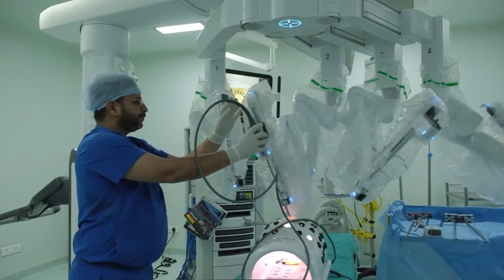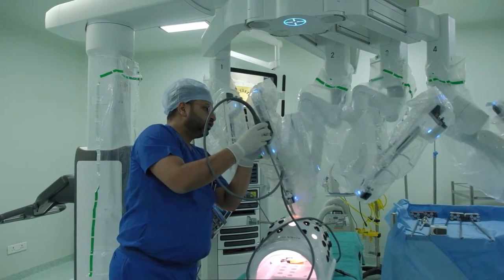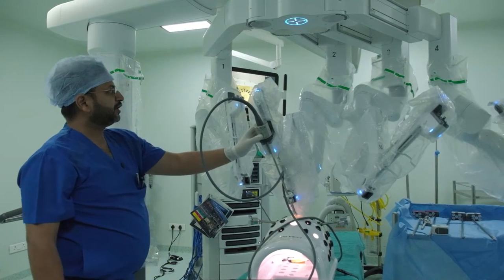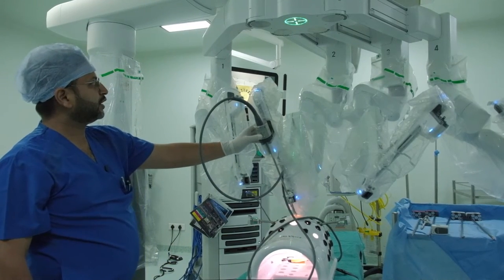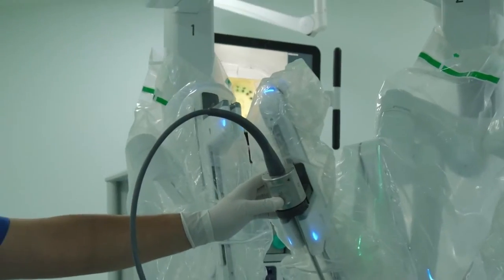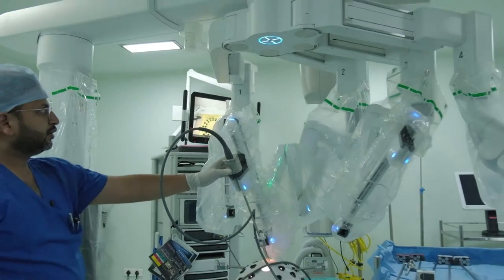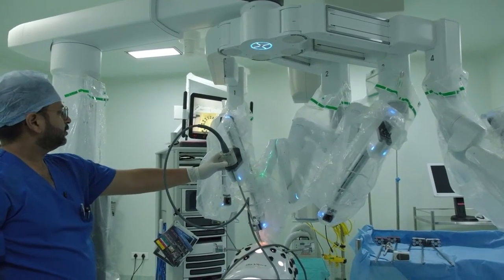And then we push the targeting button. Once I push the targeting button, the arms are going to target itself. Now you can see the boom is rotating. Targeting complete.